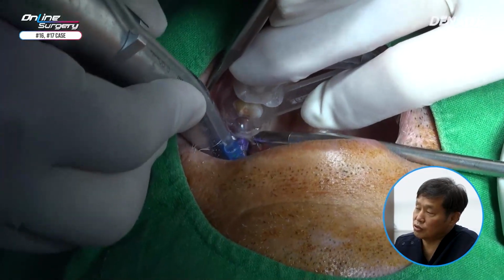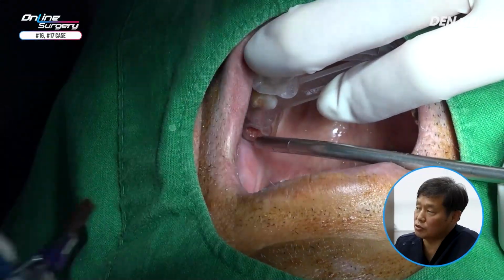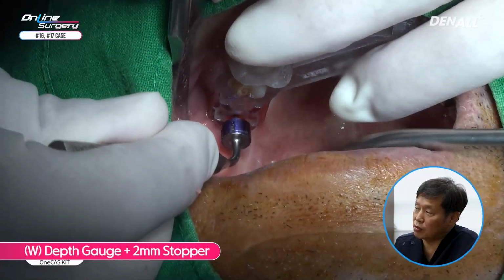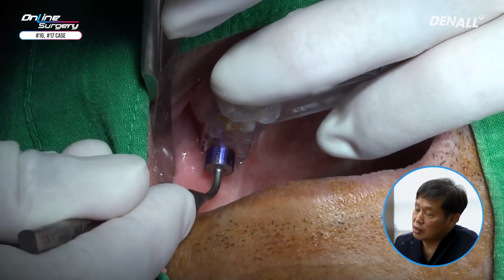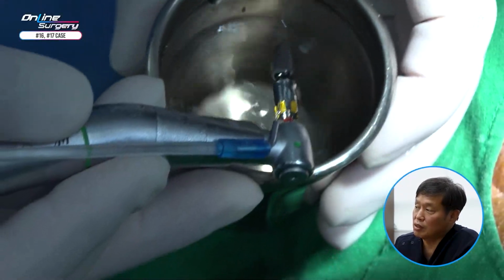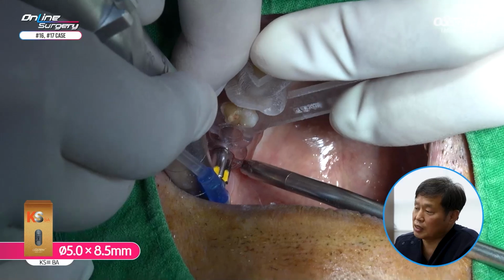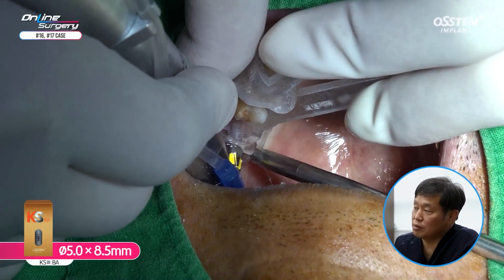In my case, with OneCAS, in the case of posterior, I assume this to be soft bone. So there should be a 1.2 millimeter gap. A 2 millimeter stopper is used to check whether there has been sinus floor penetration. You can see there is contact. At 8 millimeters, there is partial penetration, and at this stage, with no further sinus membrane lift, a KS3 BA 5.0 by 8.5 millimeter implant is placed.